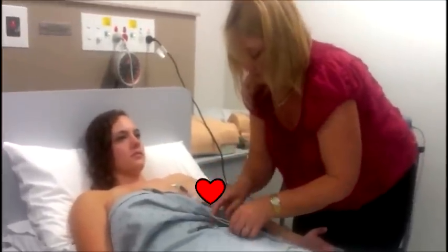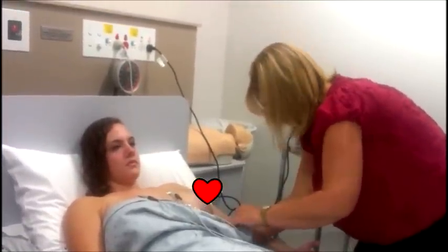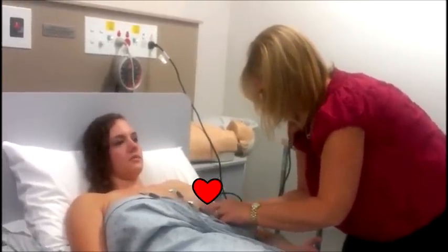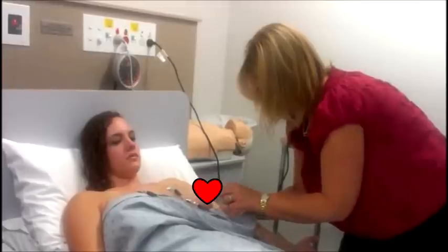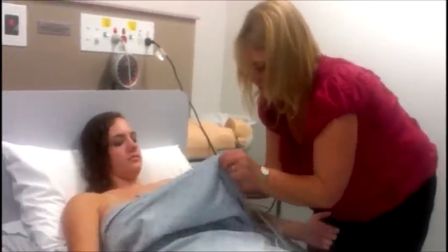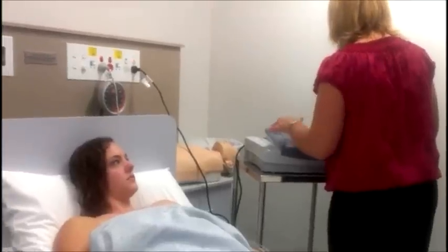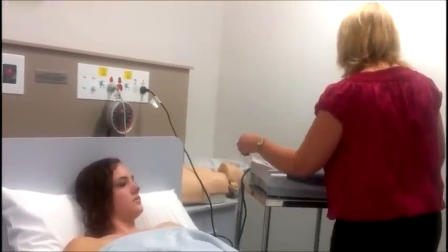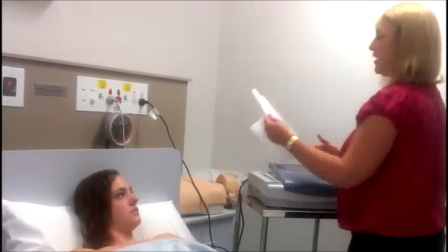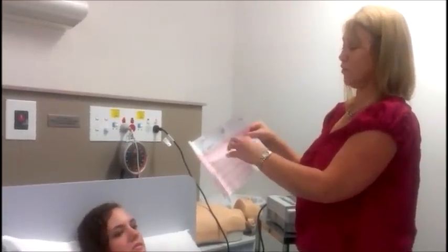Think about how the patient would be feeling if somebody was doing this to them. They're all on now, and I'm just going to cover her up because there's no need for her to remain exposed. Okay, so that's it.